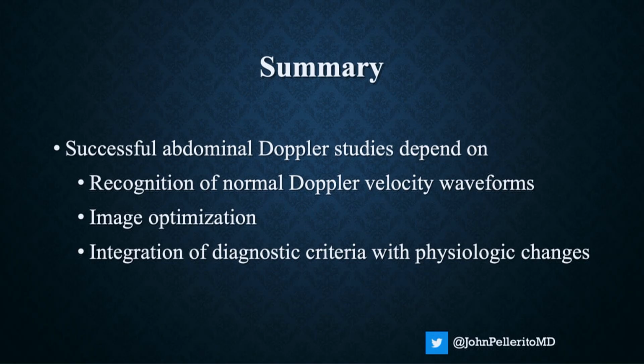Successful abdominal Doppler studies really depend on recognizing normal waveforms, looking at the changes that occur with significant stenosis. Of course, optimizing the image facilitates the examination, as we discussed, and integration of the diagnostic criteria with the physiologic changes that we see on our spectral analysis is very helpful.